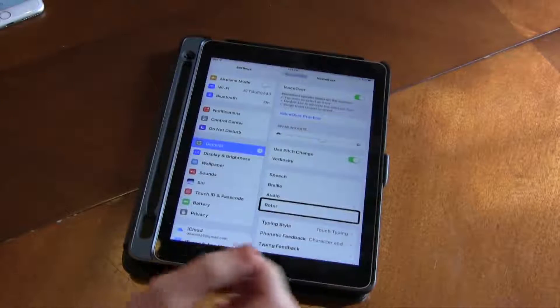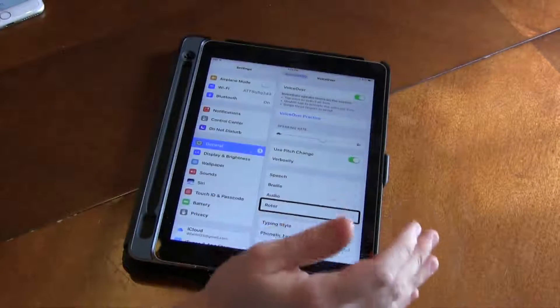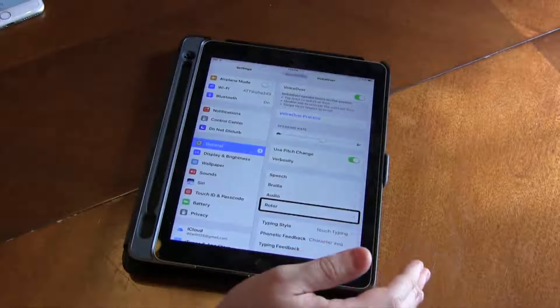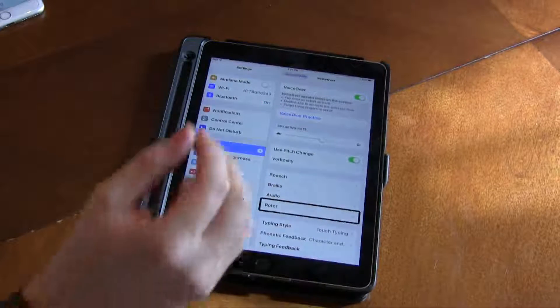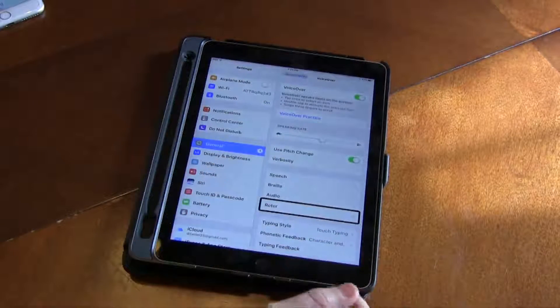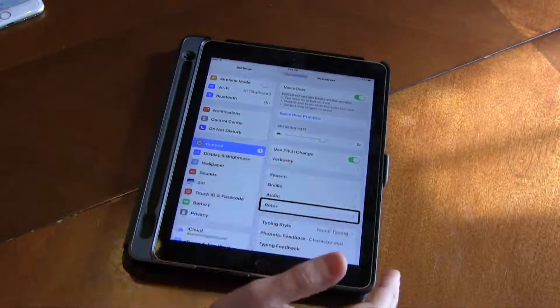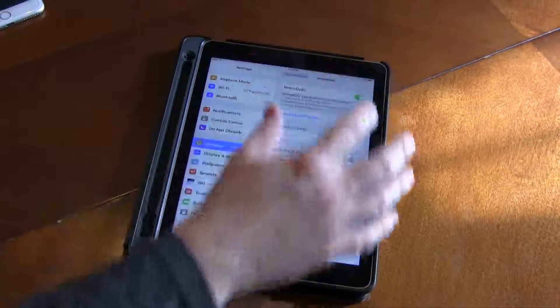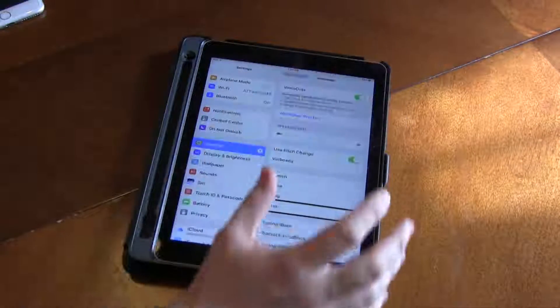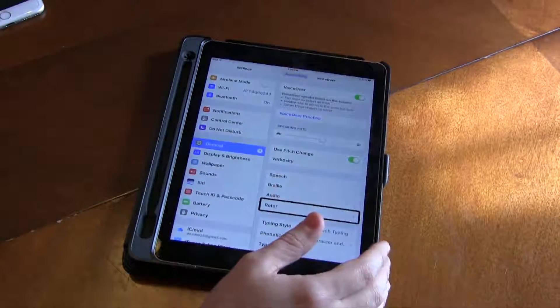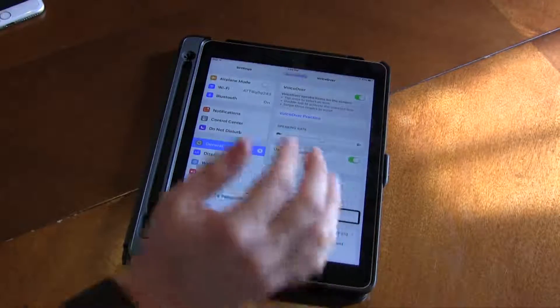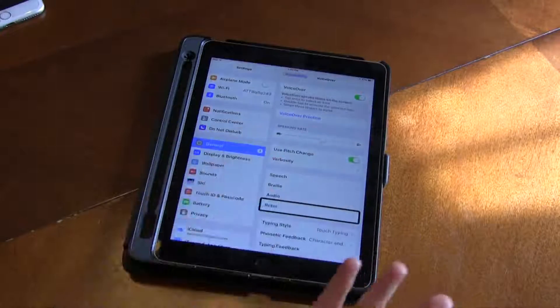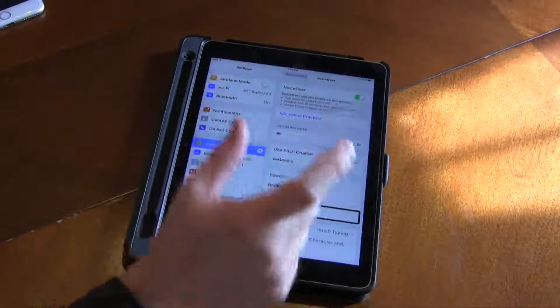Alright guys, so here we are in Settings, then General, then Accessibility, then VoiceOver. These are all of our VoiceOver settings, and the one we're on is Rotor. Now what is the Rotor?